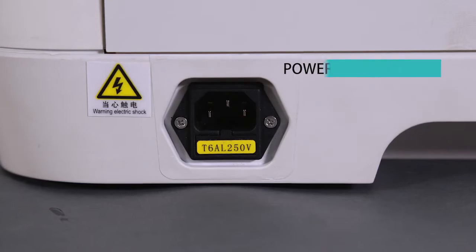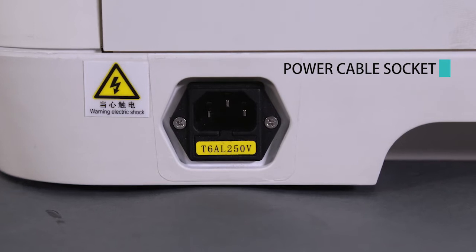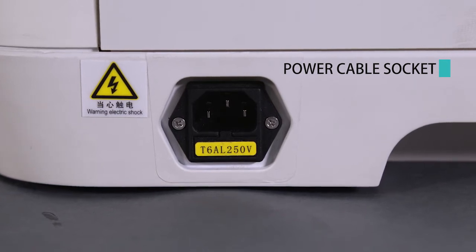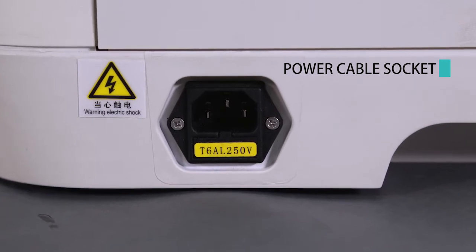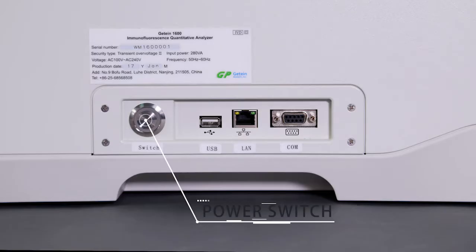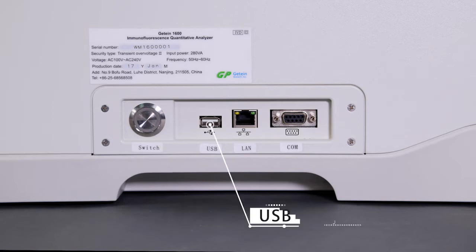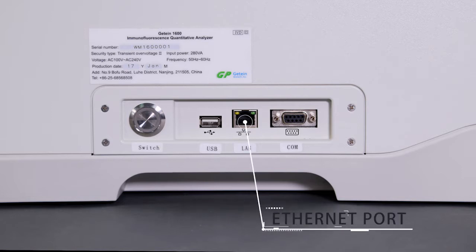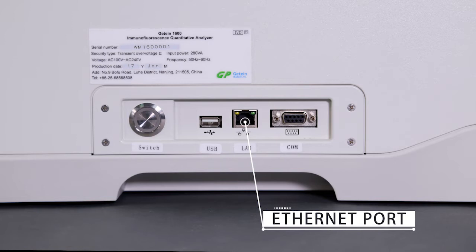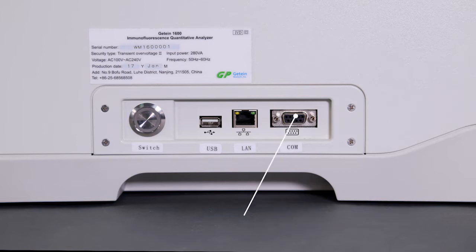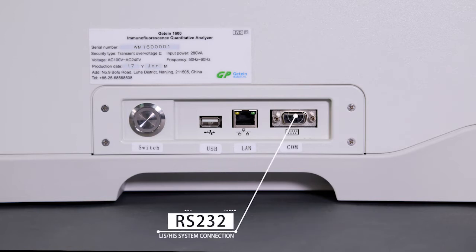On the rear end are power cable socket. On the right are power switch, USB port for system upgrade, Ethernet port, and RS-232 port for LIS-HIS system connection.